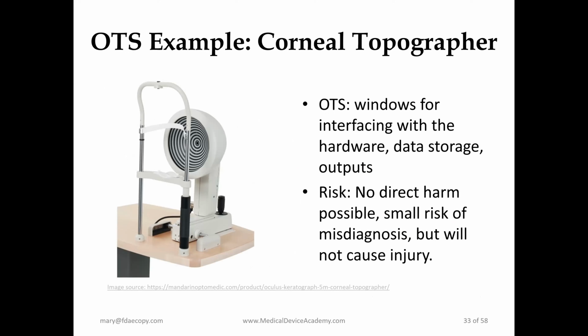So just to give a couple examples of the off-the-shelf software, and these are examples that are included in the guidance as well. So a corneal topographer. So the off-the-shelf software used in this is Windows, which is used to interface with the hardware, data storage, and outputs. So when looking at the hazards of this, there's ultimately no real or significant harm that can happen to the patient. So there's a small risk of misdiagnosis, but it will not cause injury. So this is considered a minor level of concern with regards to off-the-shelf software.